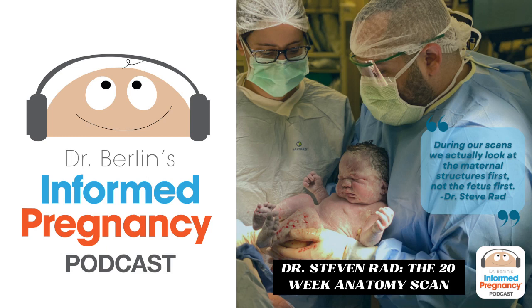So you can technically do a detailed first trimester anatomy ultrasound, first of all. And second of all, certainly by about 16 weeks gestational age, you can see a lot of the structures that you traditionally see at the 20-week scan. One of the concerns is sometimes the brain, like I was saying, isn't developed well. Not that it's not developed well, but some of the landmarks aren't there yet. But if you are really into ultrasound and a great sonographer, you are able to see some of these early structures if you are trained and have done thousands of ultrasounds or trained yourself or been trained by someone. You can start to see some of the early landmarks at 16 weeks.